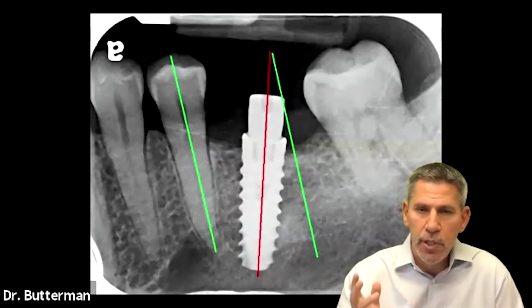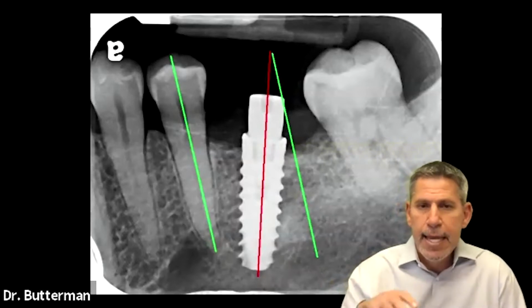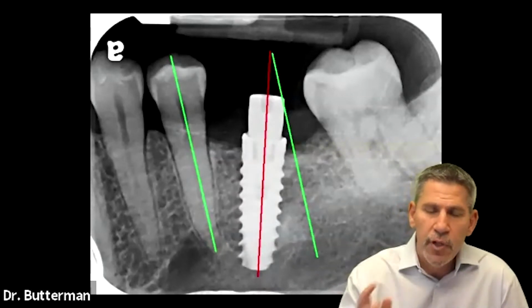And so what do you say? Well, it's probably a tight contact. So you take a little bit away from the contact and then you try and get it to go down again. And then it just seats a little bit more. And you're like, okay, well, I'm on the right path. So you take even a little bit more away.